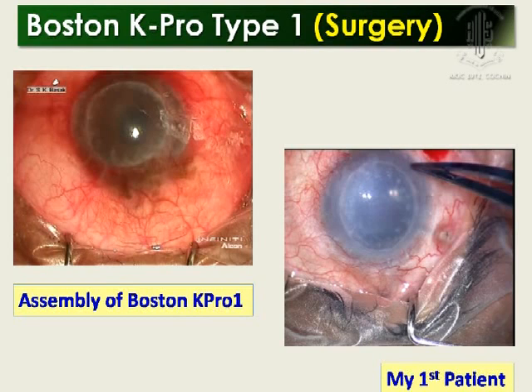This is my first patient. I am showing you because it is not so difficult. Radhika was there. It was done with an Ahmed glaucoma valve in place. I was not going too deep during trephination — I was mostly with the blade. There were a lot of synechiae, so synechiolysis with the iris spatula is very important.